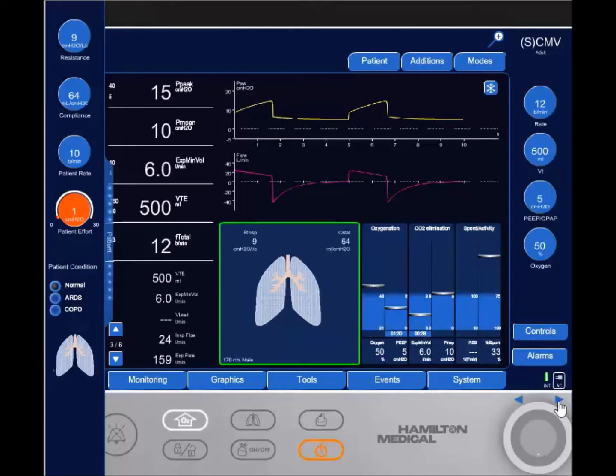So say my patient gets very agitated or is in pain, or the metabolic rate changes dramatically or increases dramatically. As you notice, I changed this, and my patient gets more vigorous. However, my tidal volume does not change, my inspiratory flow rate does not change. Or if my patient goes to sleep, my output remains the same. I'm having the same tidal volume and the same flow rates. So it does not.